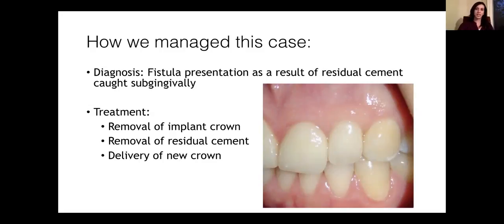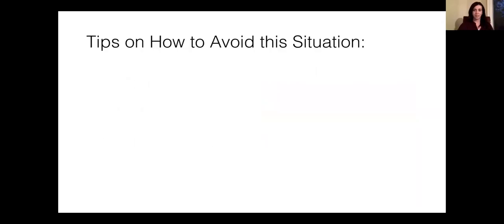So now the question you have to ask yourself is, how can you avoid this sort of situation from arising in future? Anytime you cement a crown on an abutment, an implant crown, there's always a chance of residual cement being caught subgingivally and resulting in this sort of situation. So I want to share with you a few tips on how to avoid this.